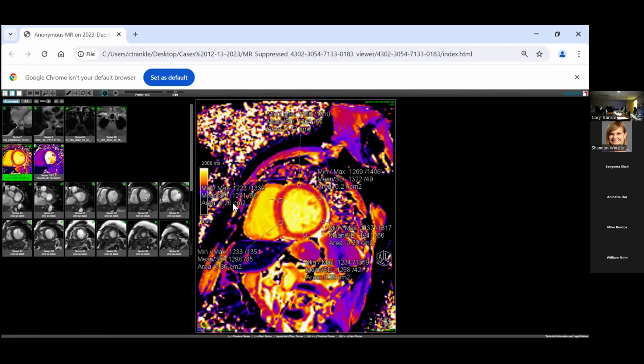Our eyes can only see from the brightest white imaginable to the darkest of black. If you're in a cave, there's no light whatsoever. You can only see 80 different shades from the brightest white to the darkest of black.